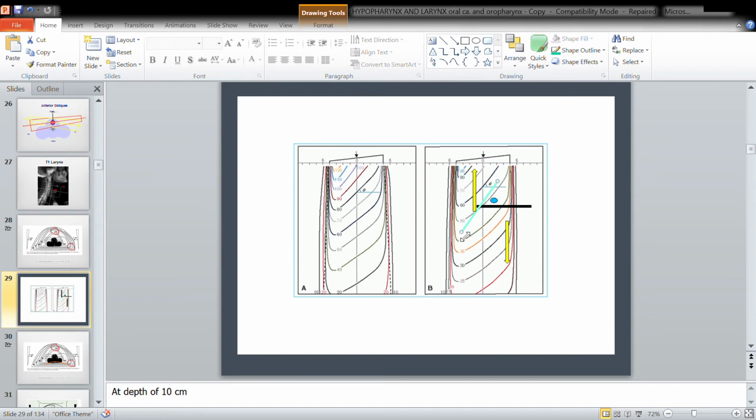With the wedge angle, we're talking about a differential dose between this end and this end. If you increase the wedge angle, you will increase the hot spots under the thin edge of the wedge, because all this will be hotter, yes? But if you reduce the wedge angle, so instead of moving it to this side, you're moving it to this side, you are reducing the difference between the dose in here and the dose in there, which means that this will move up, so you are reducing the hot spot under the thin edge of the wedge.